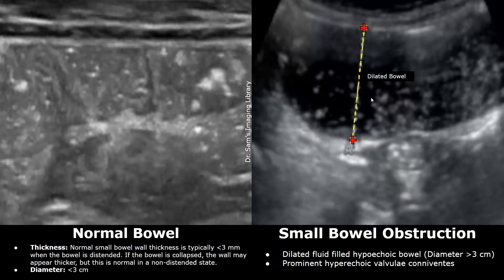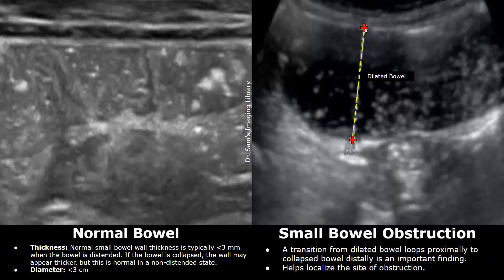Dilated hypoechoic fluid-filled bowels are somewhat easier to scan than normal bowel because they are dilated and filled with fluid. Because of the fluid content, it is easier to see small bowel obstruction on ultrasound. You may also find a transition zone — collapsed bowel can be seen distal to the obstruction. This transition from dilated bowel loops proximally to collapsed bowel distally is an important finding that helps localize the site of obstruction.